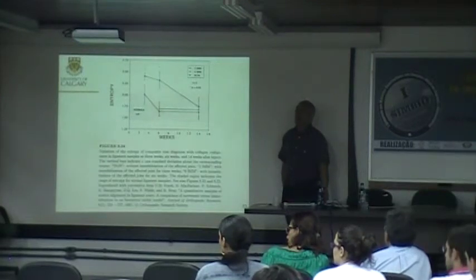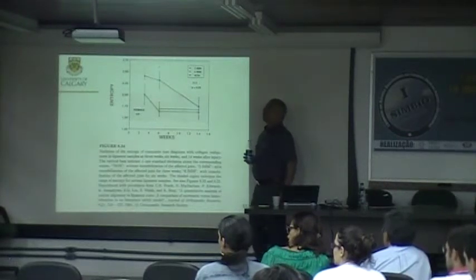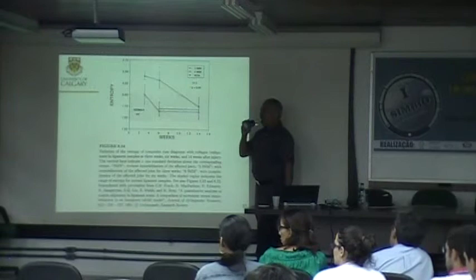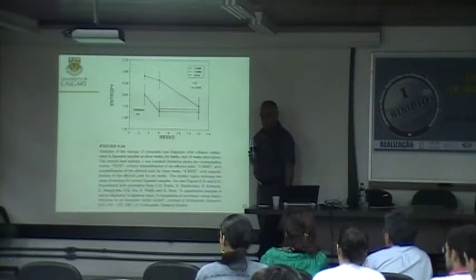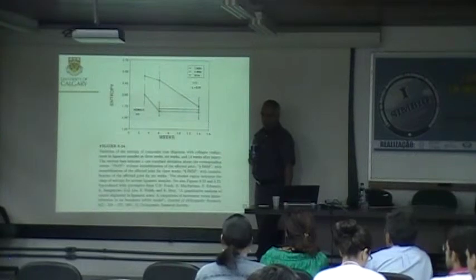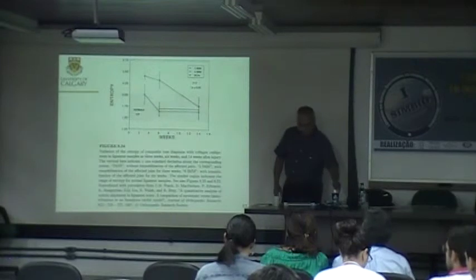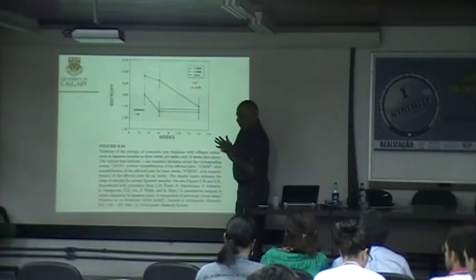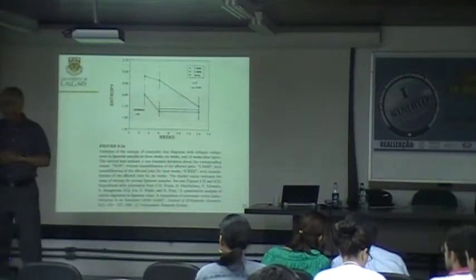There's some noise, as you said, and you don't want all that small detail because it will get in the middle of your analysis or comparison. But if you remove too much, then you lose some of the detail that will exactly lead to a good classification. The same as texture. There is some noise that you don't want, but part of the detail is not noise, it's what you want. So is there any magic to know exactly how to deal with this?